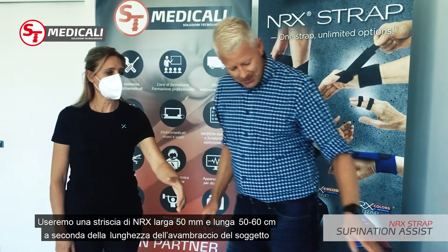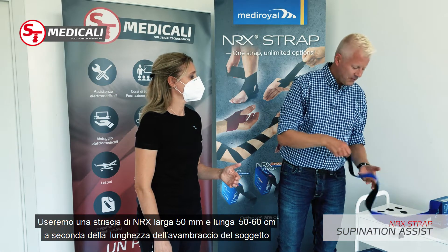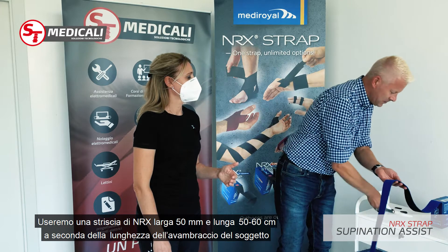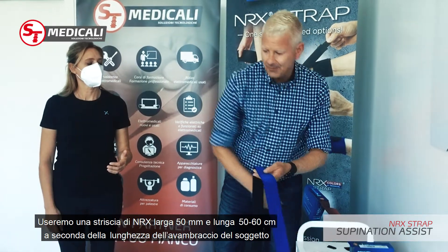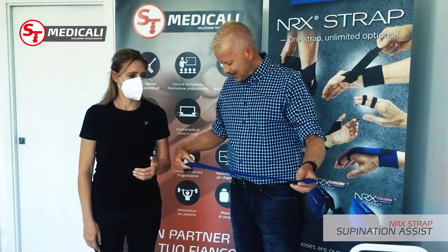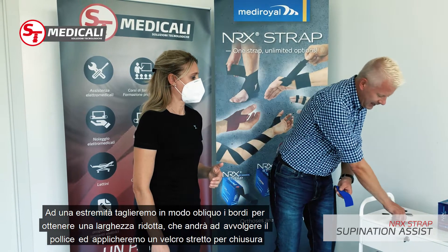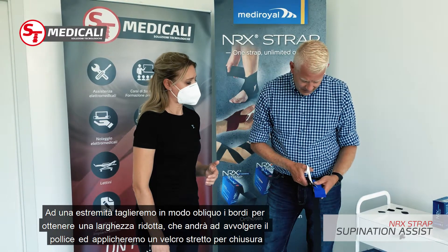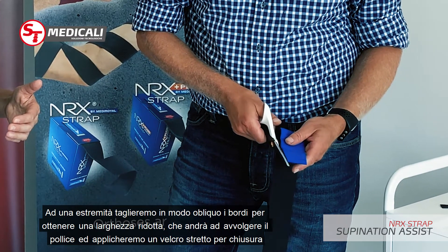What I do then is use a 50 millimeter strap and cut a length of around 50 to 60 centimeters, depending on the length of the patient's arm. At one end of the 50 millimeter strap, I cut down into a slightly narrower application, because this will be my thumb piece.